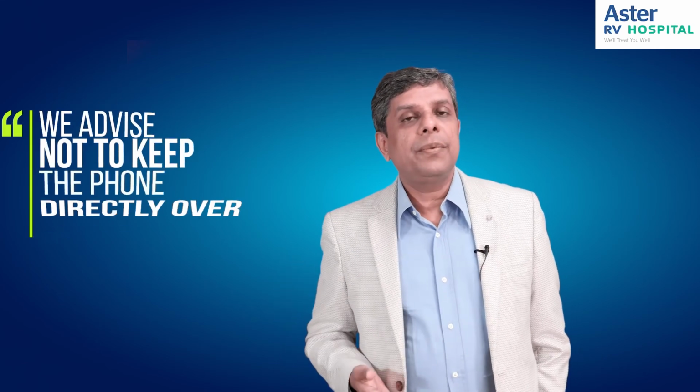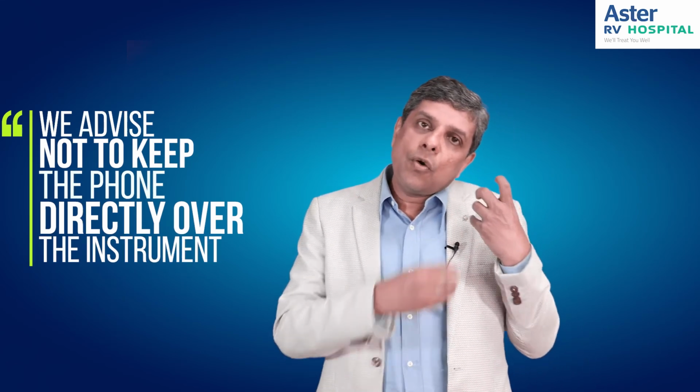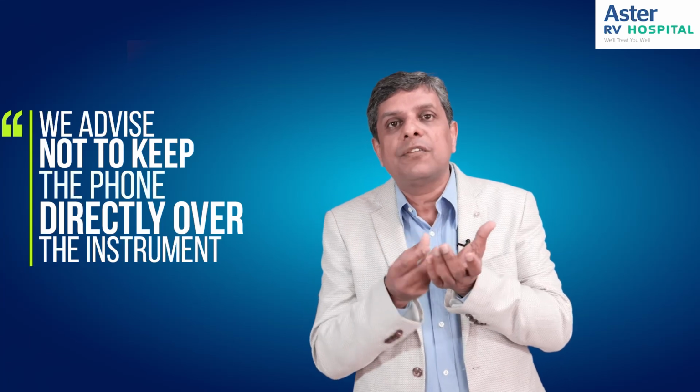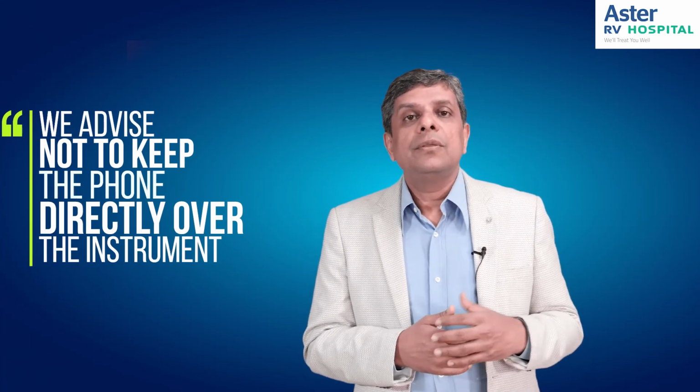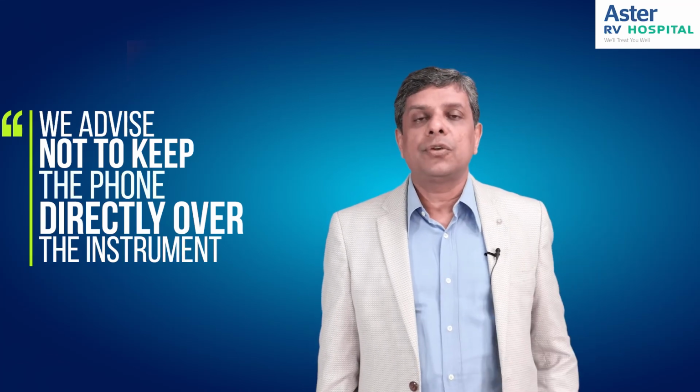Again, questions about whether we can use microwaves, watch television, or operate electronic instruments in the house, telephones especially, are also asked. All of these instruments are safely used. The only precaution we advise is for patients to not keep a telephone directly over the instrument, because the magnet in the speaker of the phone can sometimes interfere. So the patient can use the telephone on the other side or keep it at a distance, and that should not be a problem. So once a pacemaker is implanted, normal life can go on.